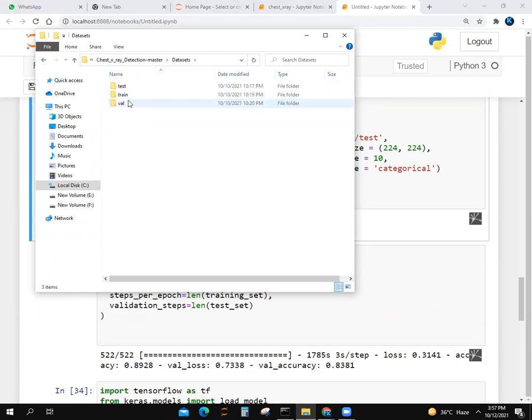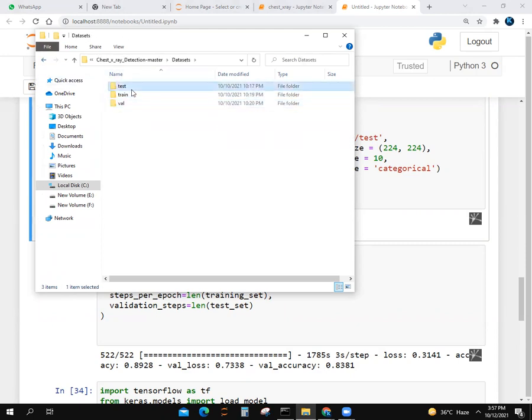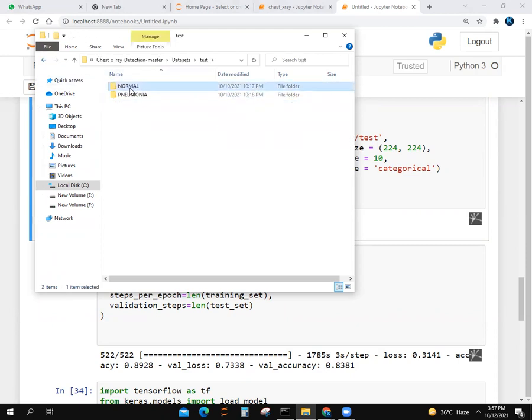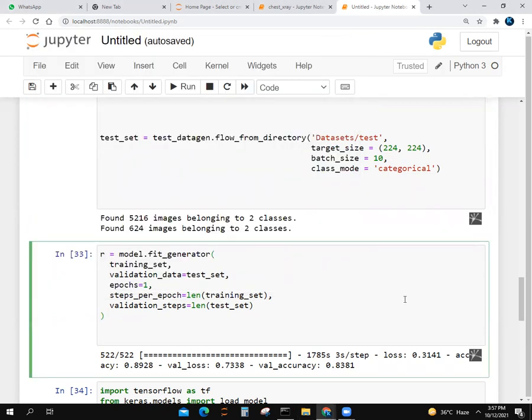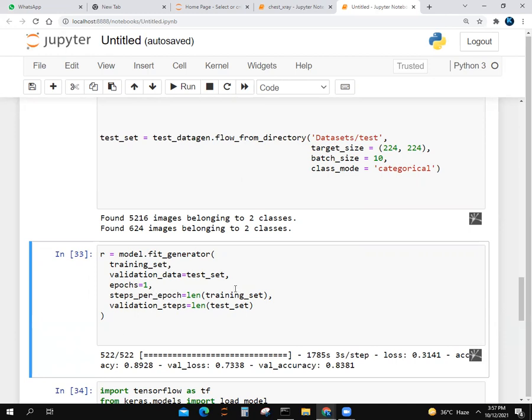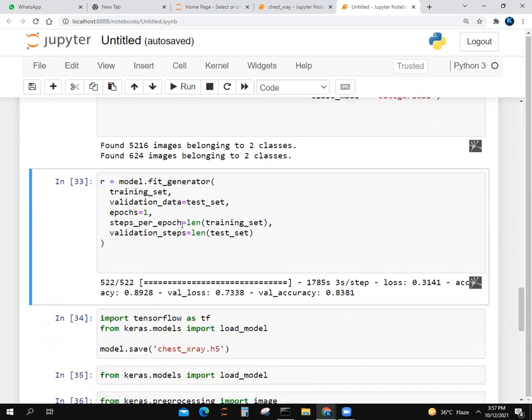If I go to test, there are two classes: normal and pneumonia. We use model.fit_generator with training set and create a validation variable for test set. We run for one epoch with steps_per_epoch as length of training set and validation_steps as length of test set.